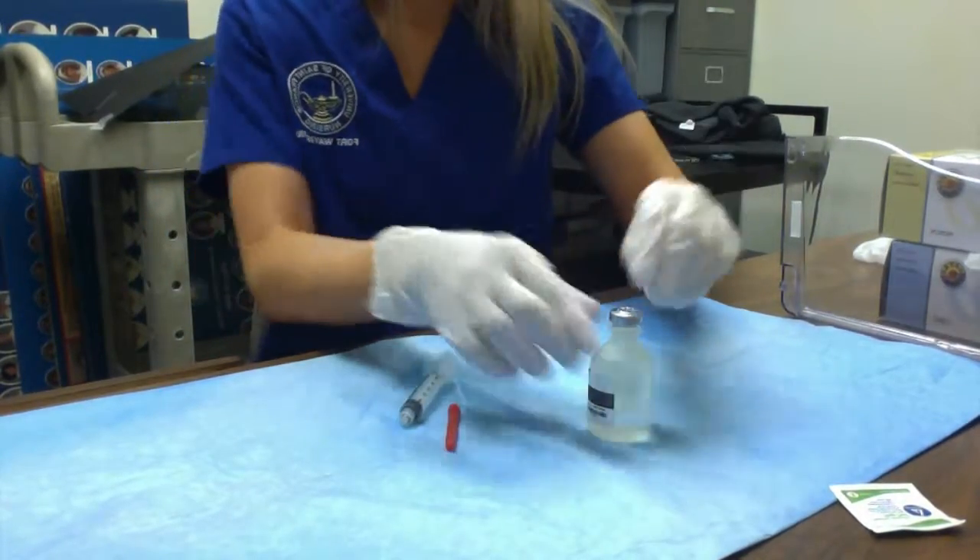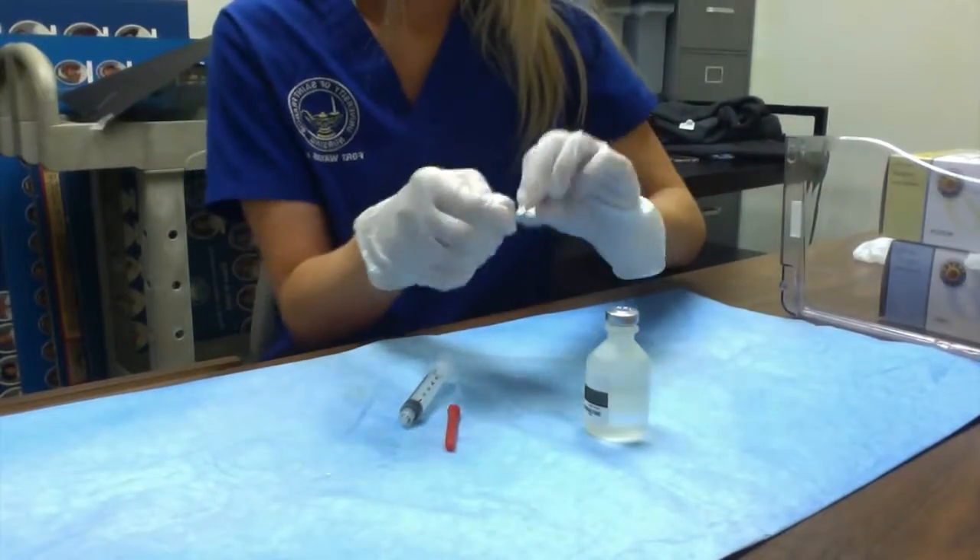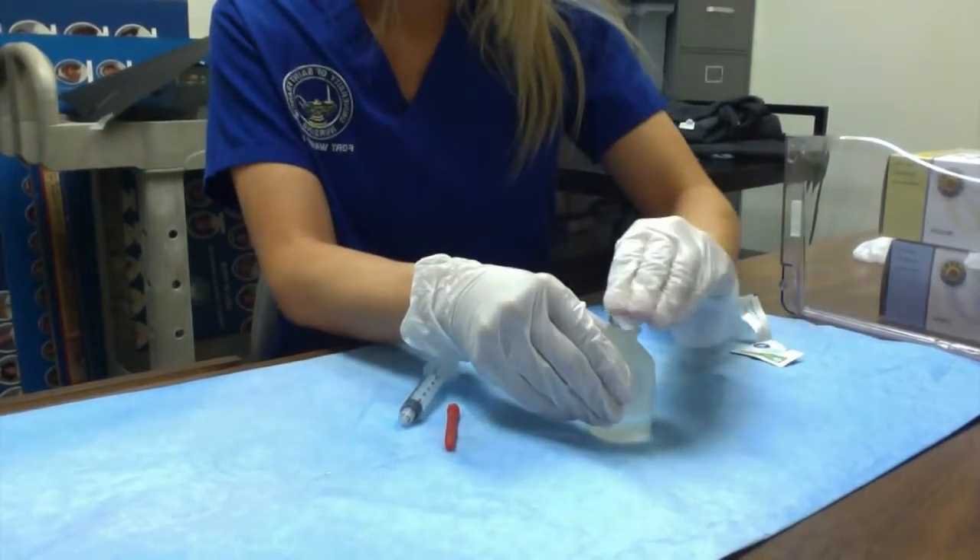I'm going to remove the vial cap if it had one, then scrub the top of the vial.